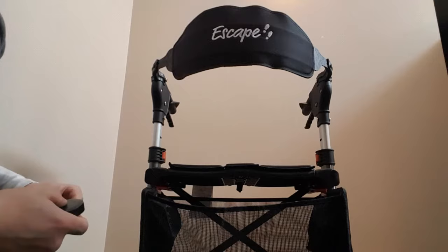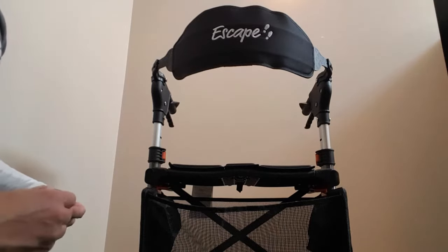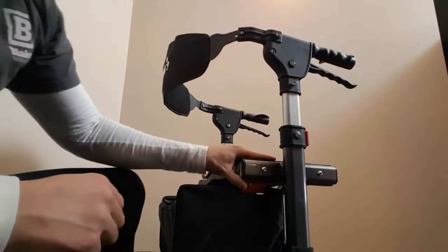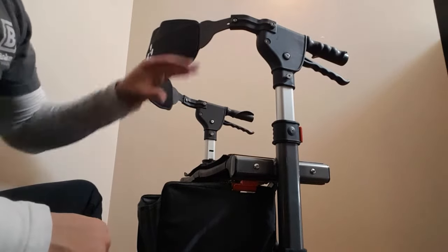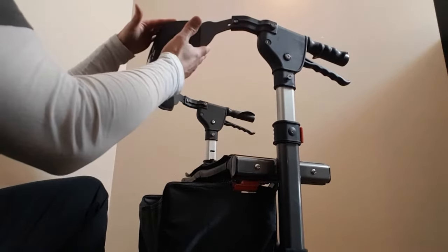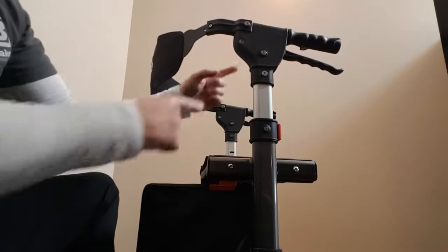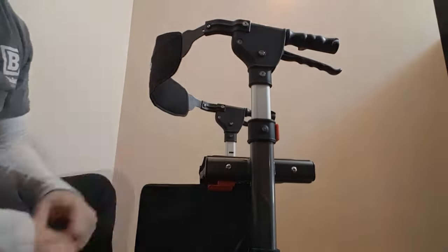Lots of room for most people in a non-bariatric application. What I found that's really amazing that nobody else has thought of yet, as far as I know — this is a really cool design. Sometimes we get those shorter clients that are around five foot two and they find that the back is up too high, so when they're sitting in here the backrest is up closer to their shoulders, maybe too far away. So what Triumph has done with their design of the Escape is they're able to move the backrest from this location down to a lower position, and I'm going to show you how to do that now.